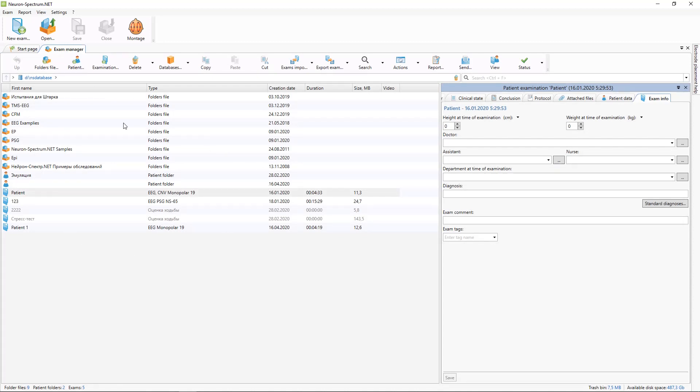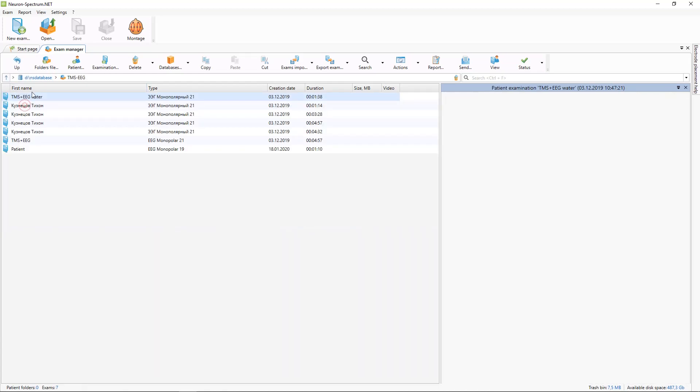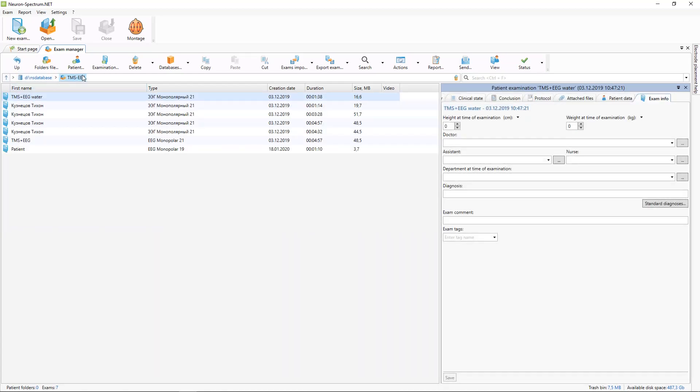Here are our patients and examinations. Here you can see the path to your database and path to your current examination.